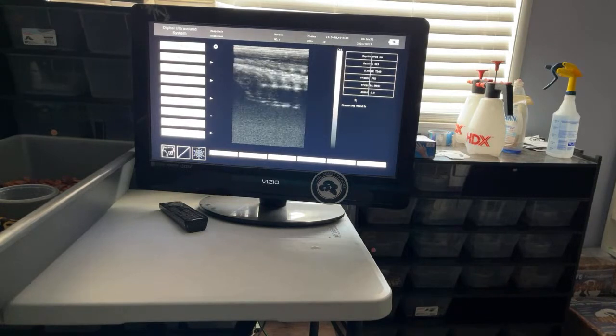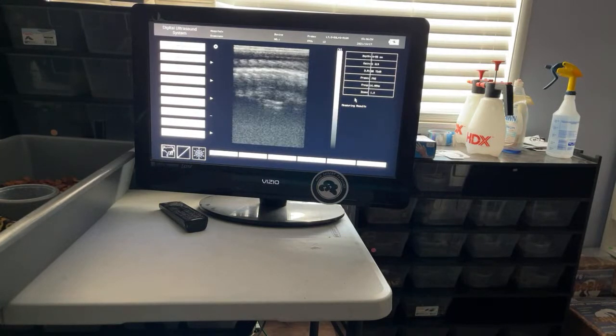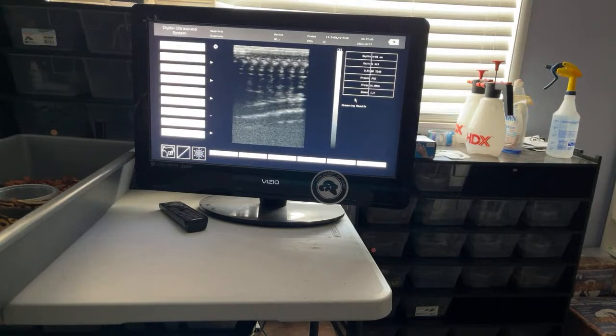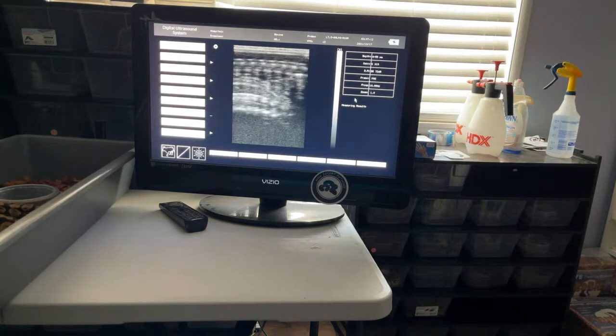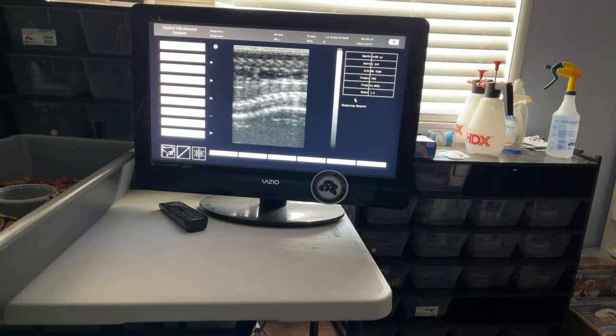The laptop's on delay, so if you look at the screen, make sure it's focused. So I'm about a third of the way down, trying to find the gallbladder on this girl. We got some little tiny follicles right there. That peanut up on the camera. Yep. All right.